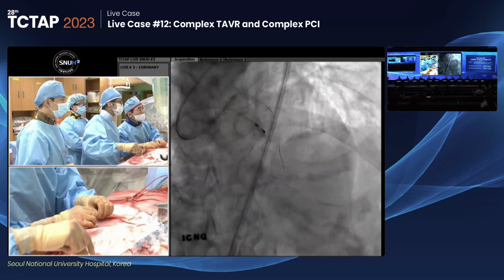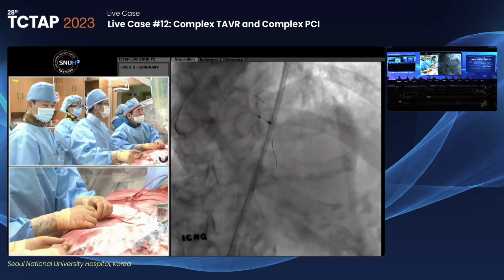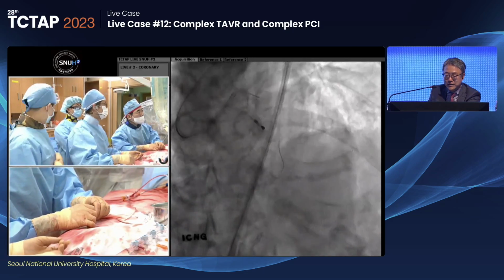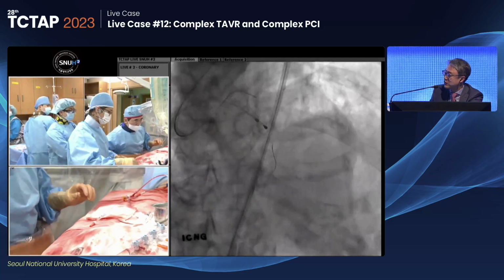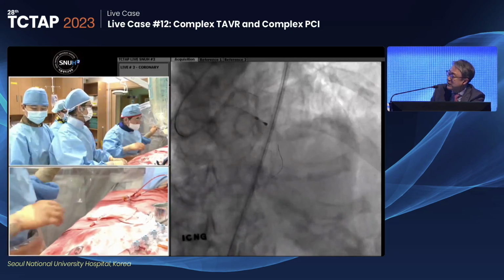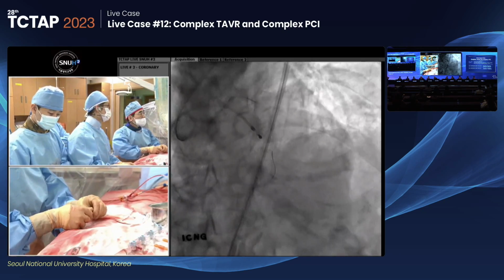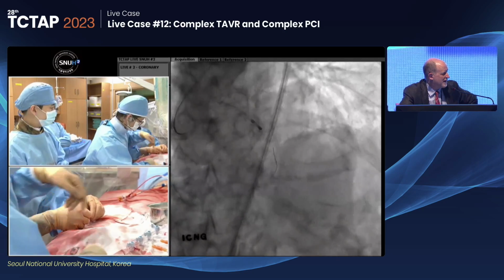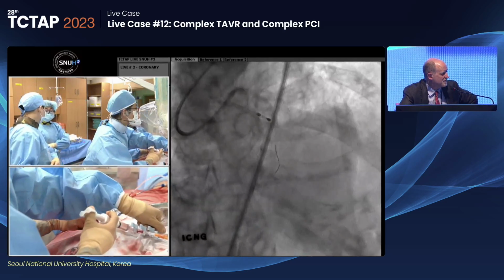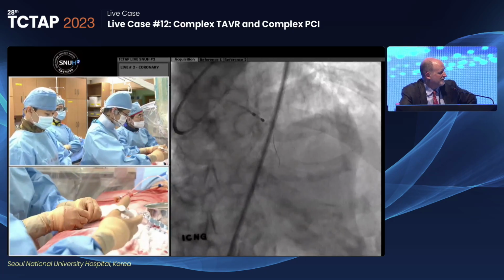This patient's ejection fraction is 22, and this is supported by IABP. The reason is that Impella is not available in Korea. How about the US? Usually you do use Impella. Well, I think it depends. We haven't seen the peripheral anatomy, and the ejection fraction did go up to 40%. I'd be interested in the LVEDP or some hemodynamic data before saying so. I really do agree with you.